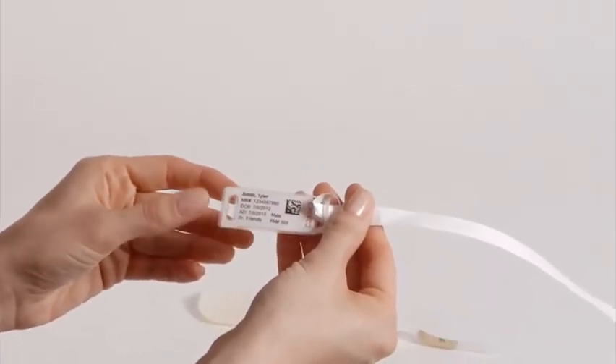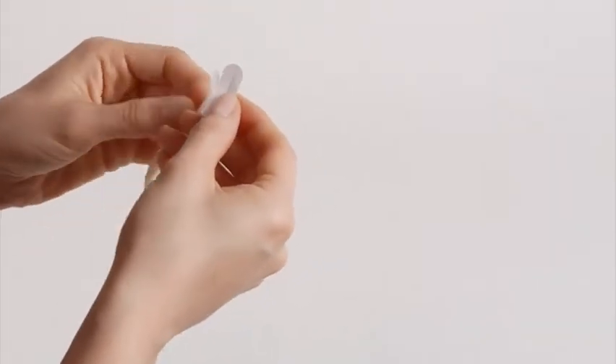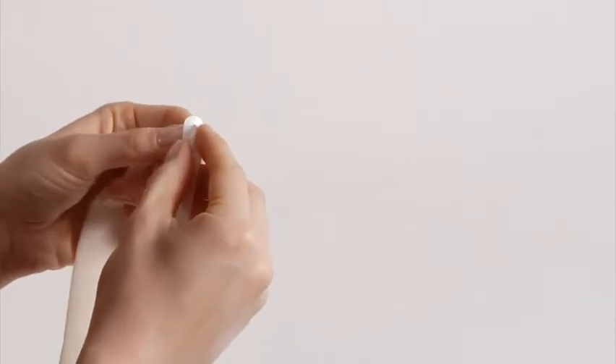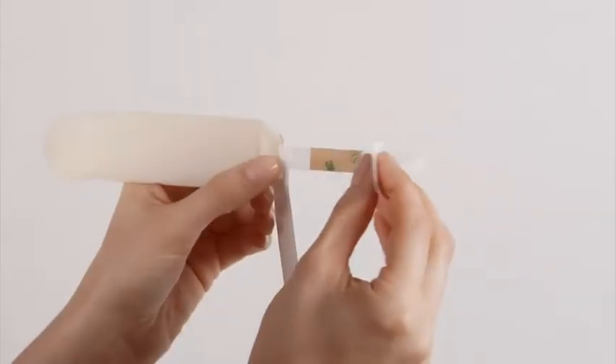To attach the swaddle band to the Comfy Cuff, insert the end of the swaddle band with the smaller slot onto the Velcro tab of the Comfy Cuff. Then slide the second ID tag onto the Velcro tab.